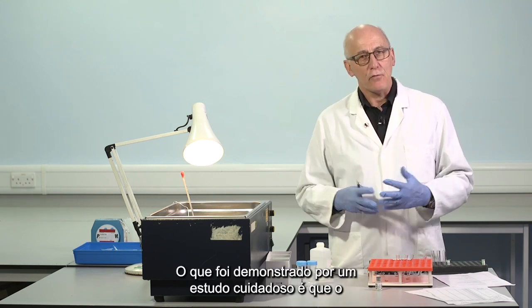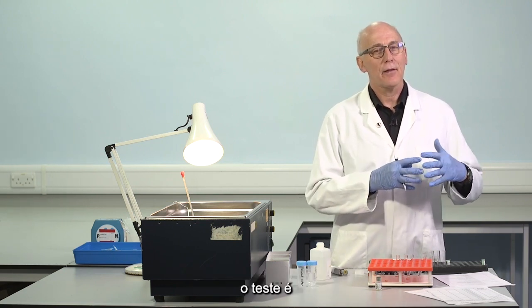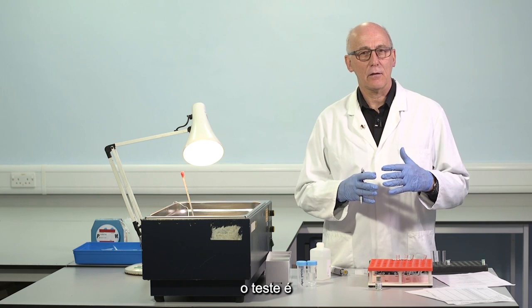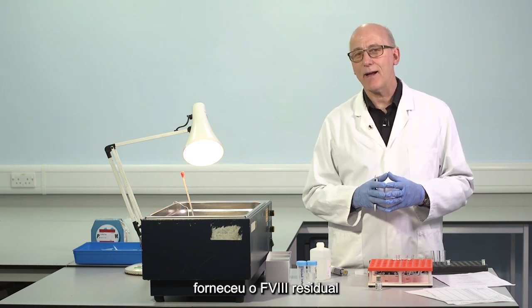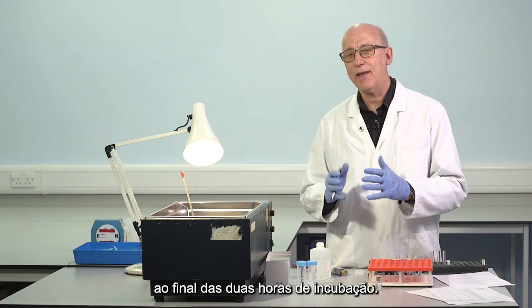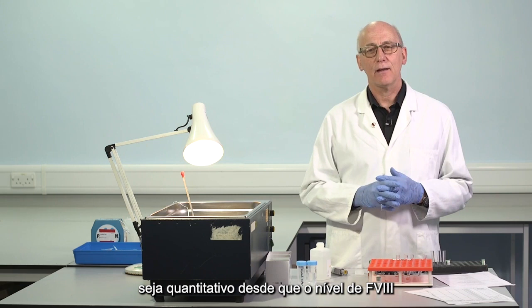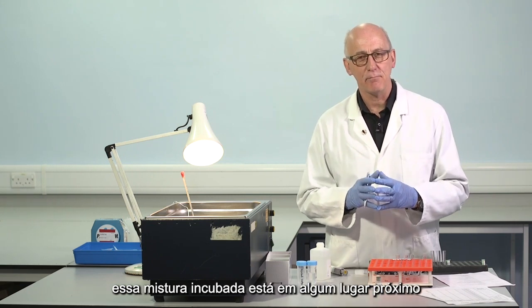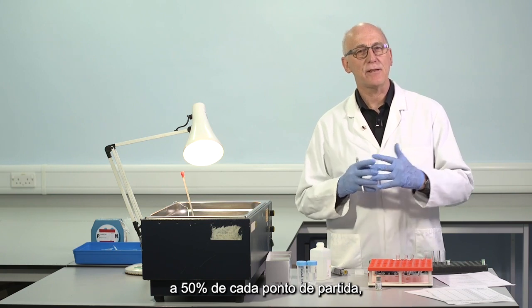But what's been shown by careful study is that the assay is fully quantitative provided the residual factor VIII at the end of the 2-hour incubation is somewhere close to 50% of its starting point.